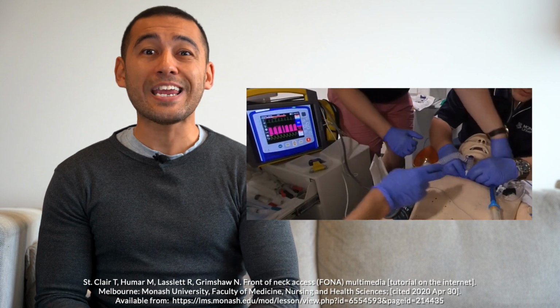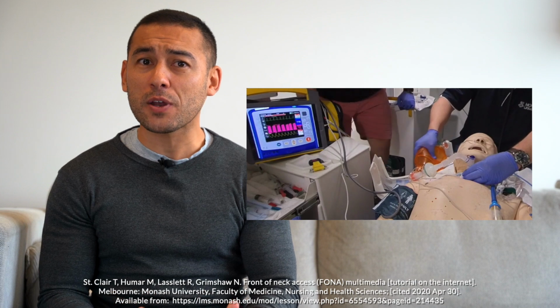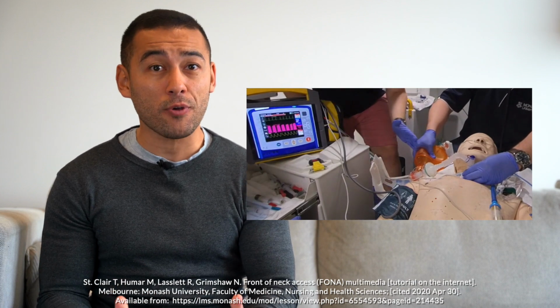This may require an increased respiratory rate for a short period of time. It is important to remember that although the respiratory rate can be safely increased, the tidal volume should remain the same at 6 to 7 mL a kilo. This maintains a lung protective strategy and reduces the risk of lung injury and hemodynamic compromise. Once the patient's SpO2 and end-tidal CO2 have normalized, the respiratory rate can return to 12 to 16 breaths a minute or according to clinical need.